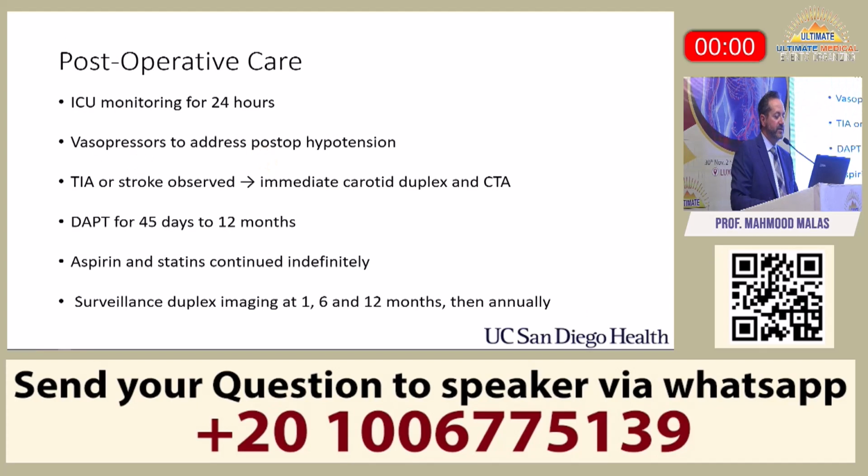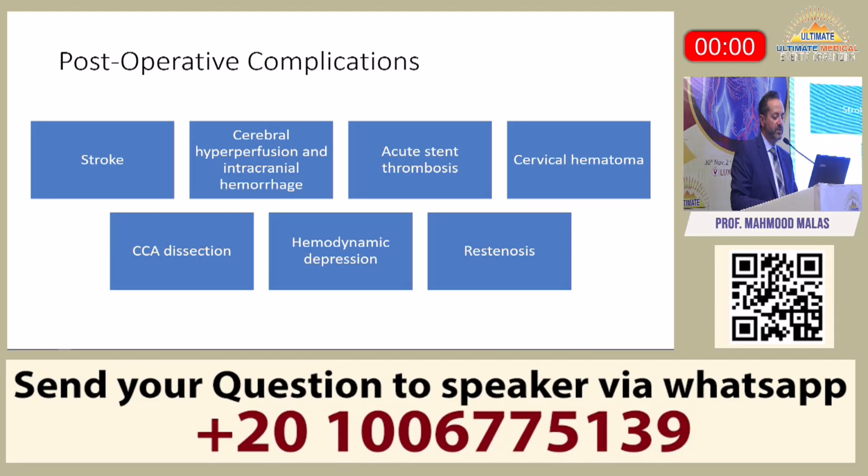All right, so after that, you put them in the ICU and you watch them just like any carotid intervention. And these are the complications that we already talked about. I tend to put a drain in them and remove it the next day, very small drain so they don't get hematoma. Critical to reverse the heparin with protamine.